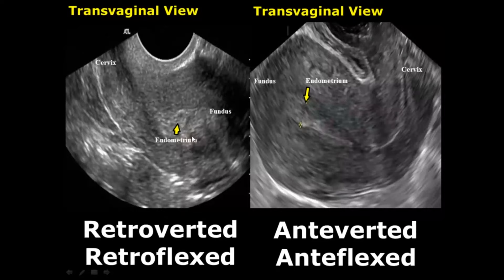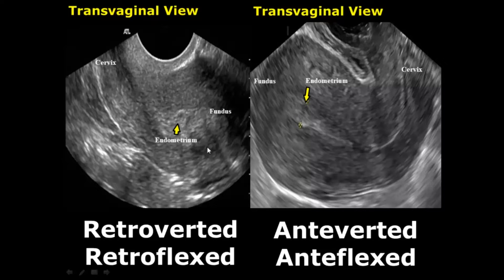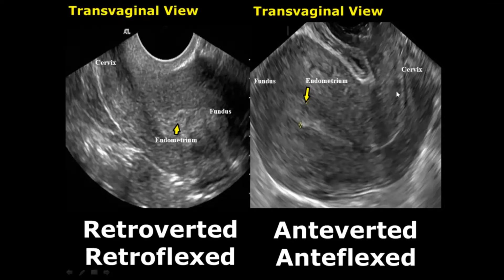In a retroverted and retroflexed uterus, the cervix is tilted posteriorly and the body of the uterus is also facing posteriorly. The bladder will be appearing on the left side of the image. The cervix is not very clear in this image, so we can use a combination of transabdominal and transvaginal views to determine the actual location of the uterus.